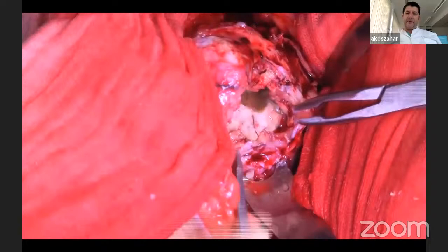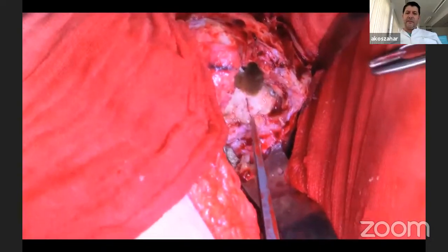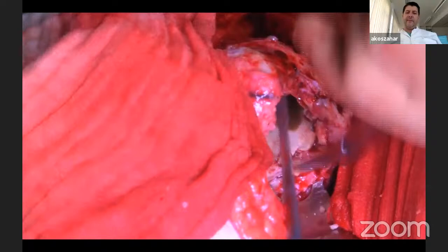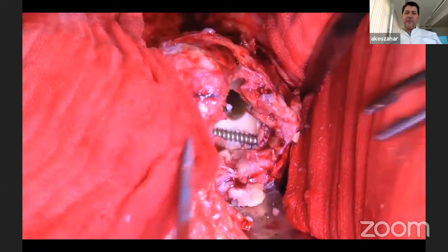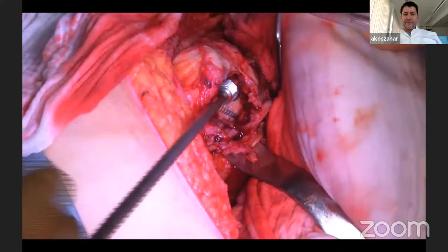In the same way in the hip, after removal of the implant, you have to remove the cement. When you have cement inside, all the cement particles may have a biofilm membrane and bugs on the surface. So it is mandatory to remove all the cement, all the foreign material.